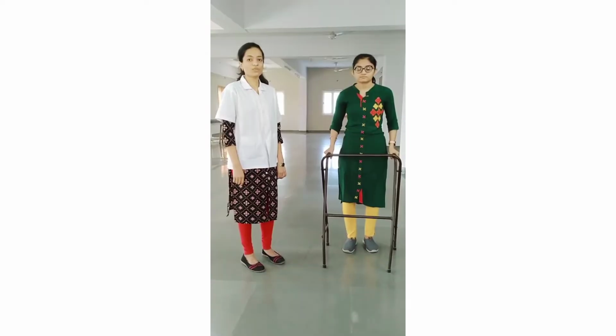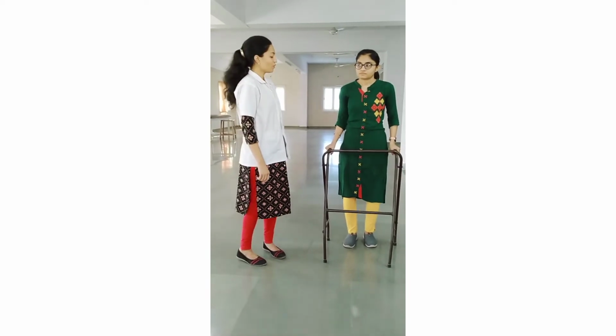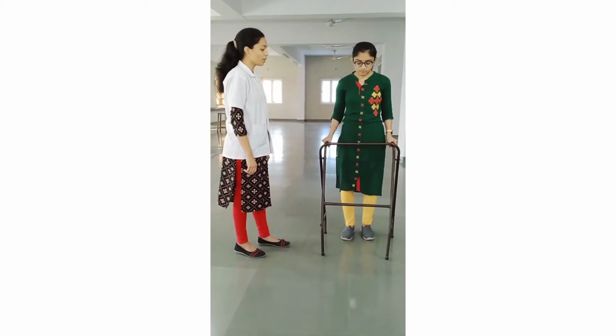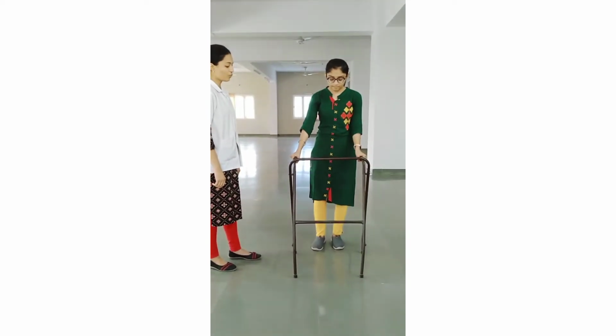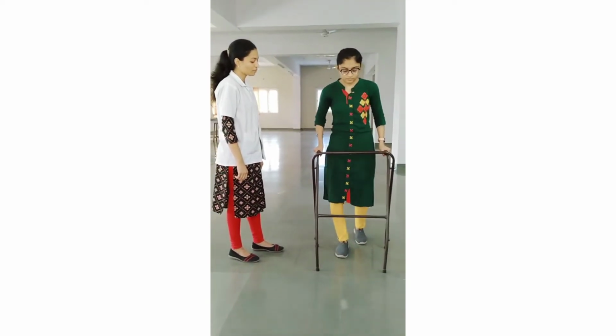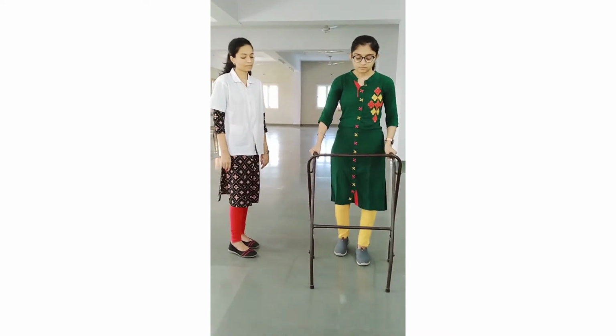Three types of gait pattern in a walker. First is full weight bearing, second is non-weight bearing, and third is partial weight bearing. First, full weight bearing. Here, the patient's right leg is affected. First, move the walker forward up to the patient's arm length. Then move the right leg, then the left, and the cycle is repeated.